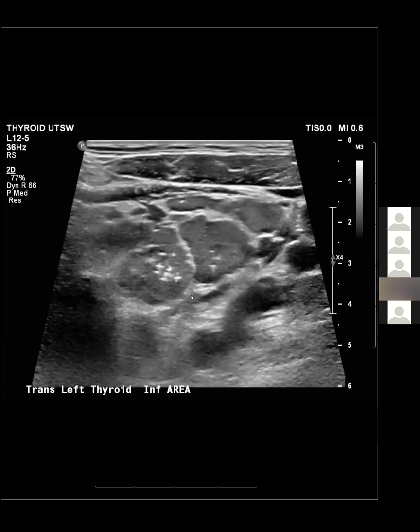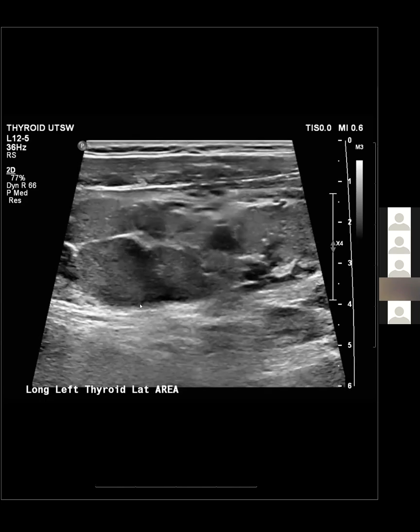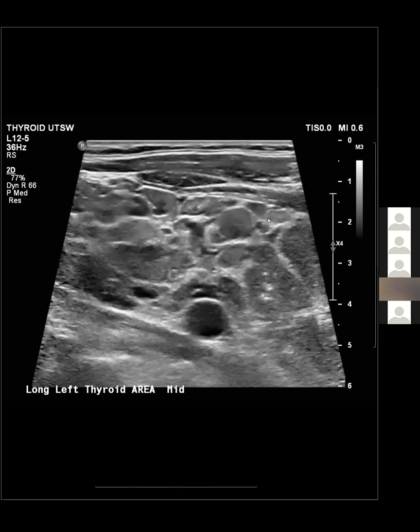And this is actually a morphologic appearance of the thyroid that I had also found in literature research as associated with Cowden syndrome. This is basically innumerable adenomatous nodules replacing the normal thyroid gland. So the normal thyroid gland gets compressed and fibrotic, and then the normal thyroid bed gets replaced by innumerable adenomatous nodules. So, wow.